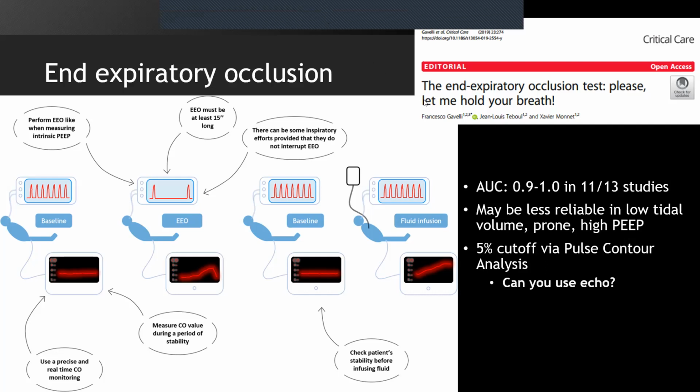Any thoughts? It's like a trick question. Your heart says no, but I'm the echo person, so I want you to say yes. But the answer is no, you can't use echo. And so this is one important point too.